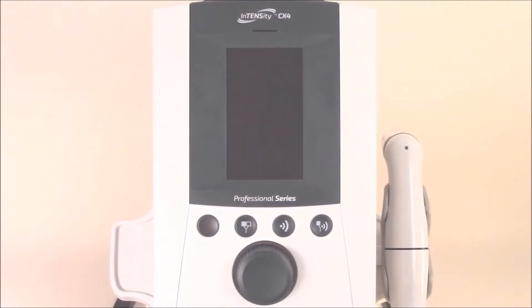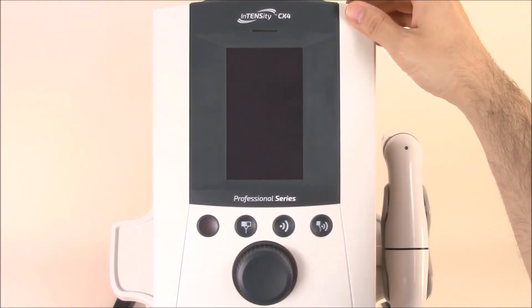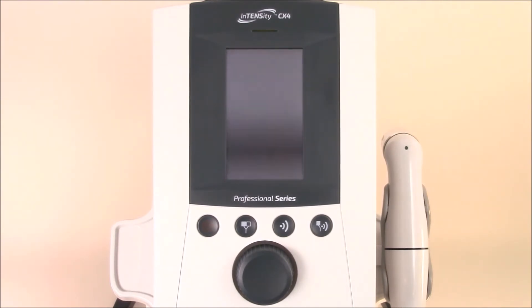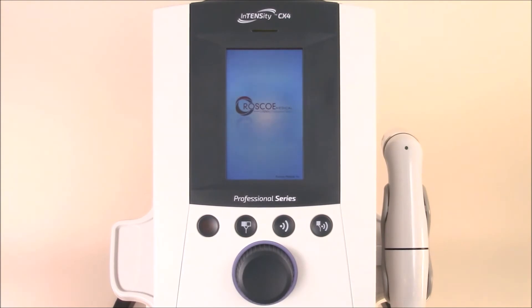Now that we've plugged in the Intensity CX4 and powered it up, we're ready to turn on the machine. Simply hit the power button in the back, and you'll hear the device power on. When you hear several beeps, you know the unit is self-calibrated and ready to go.